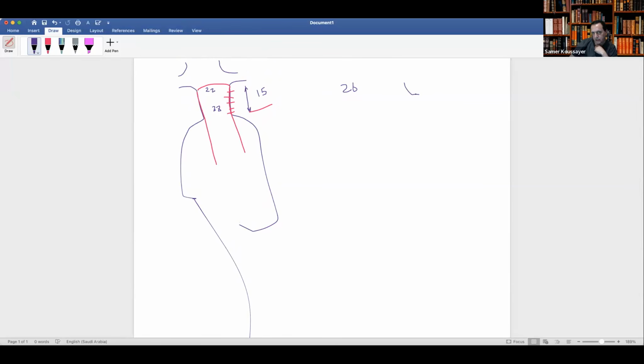This is a short neck here, like this one, going this way, and then the aneurysm. All right.